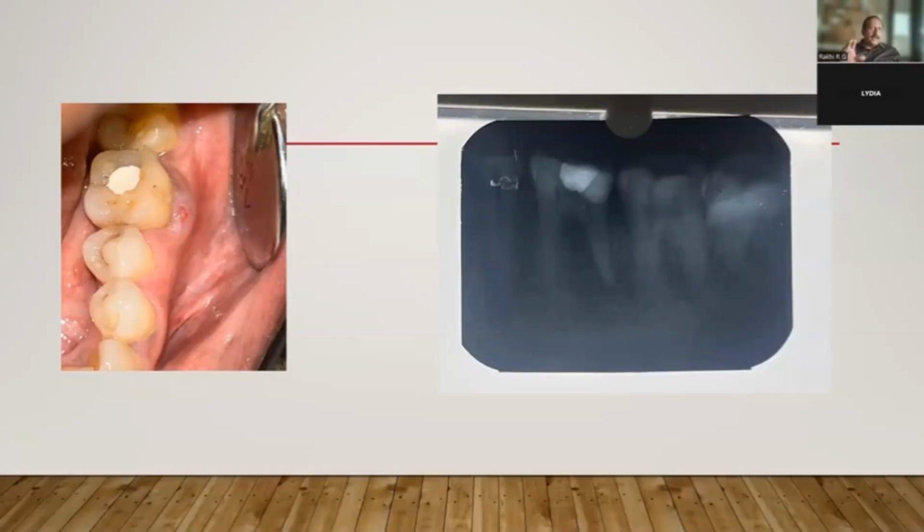Whereas if it is only in the interradicular or furcation area, that means you have a periapex which is quite favorable for your implant placement, or intact bone is expected in that area. The furcation area has a good amount of bone loss, but the periapex and the socket area will have intact bone throughout all the surfaces. All four surfaces plus the apex will have bone.